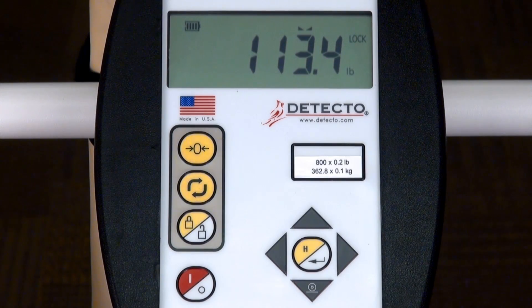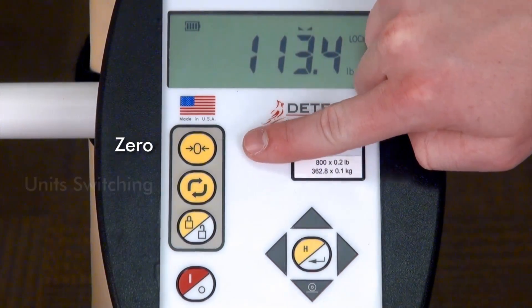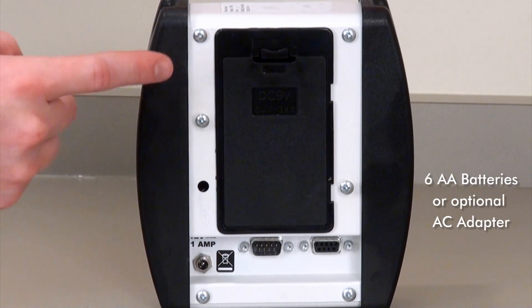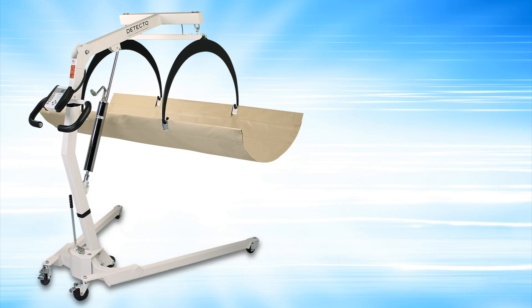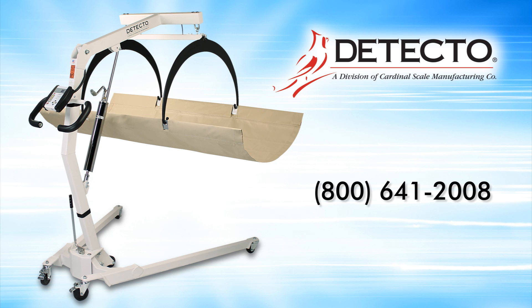Detecto in-bed scales utilize the USA-made 750 indicator, which is very simple to operate with keys for zero, unit switching, and lock release. It is powered by six AA batteries or an optional AC adapter, and is equipped with a serial interface port, making it EMR and EHR ready. To find out more, call 1-800-641-2008 or visit www.detecto.com.